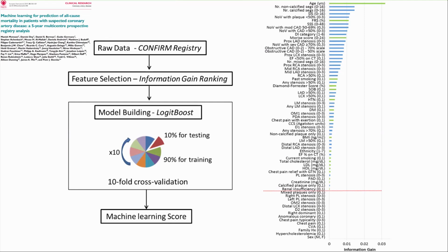So this is a study from the CONFIRM registry. And what was done here is the coronary CTs were read, and every possible factor from the CT was extrapolated and recorded. So here we have 40 coronary CTA factors: the distribution of plaque, the type of plaque, the location of plaque, the segment involvement score, the segment stenosis score, the degree of calcification, the cal score, lots and lots of factors, everything you could possibly read from a coronary CT.